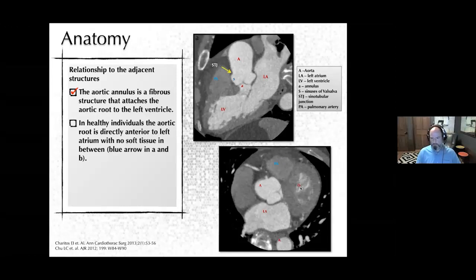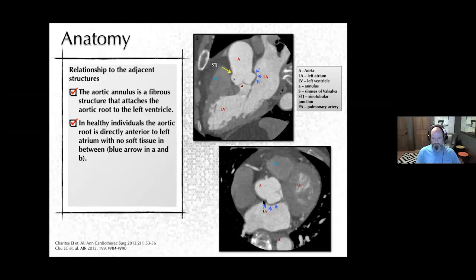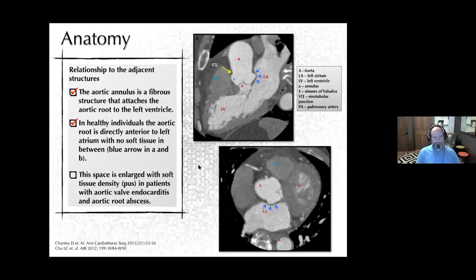Here we have the ascending aorta, left ventricle, pulmonary artery, left atrium, and descending aorta. Here's that retro-aortic space — also the space where a retro-aortic coronary artery or a sinoatrial nodal branch off the circumflex may travel, but nothing else should live there. You should just have periaortic fat, which is black, with the walls a brighter shade of gray. This space is enlarged when we have an abscess — we'll show examples of that.